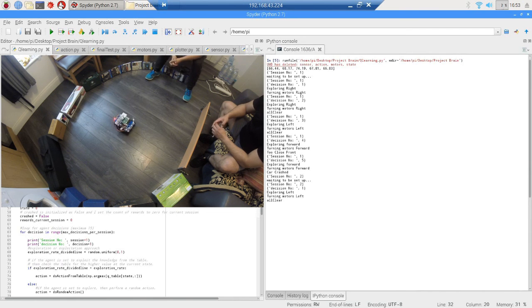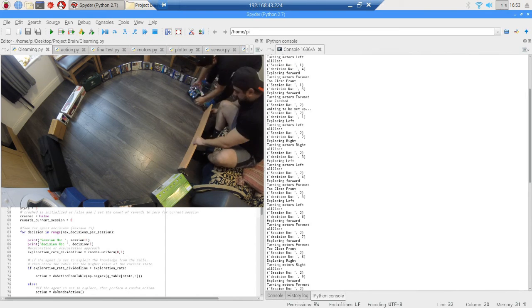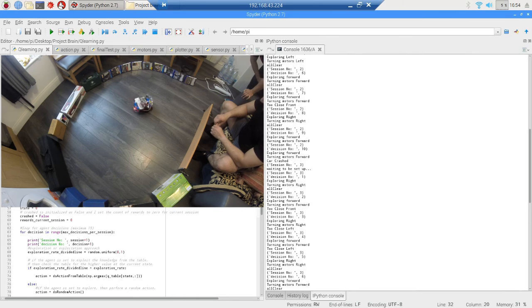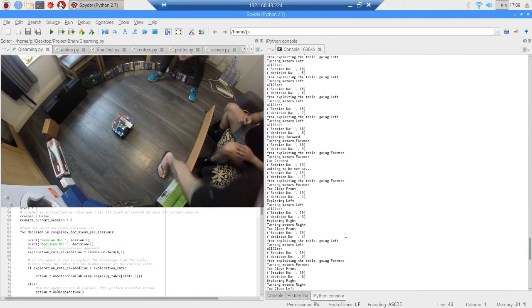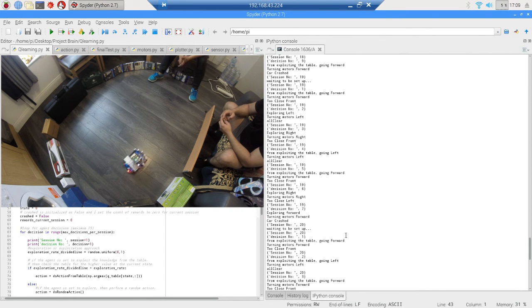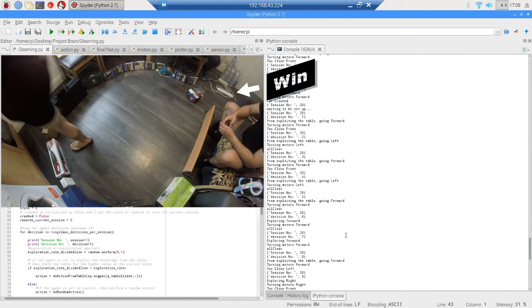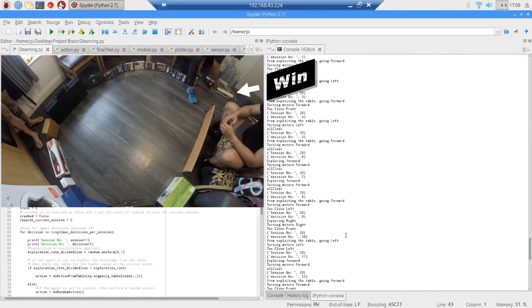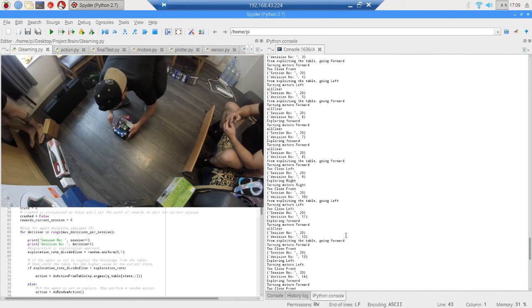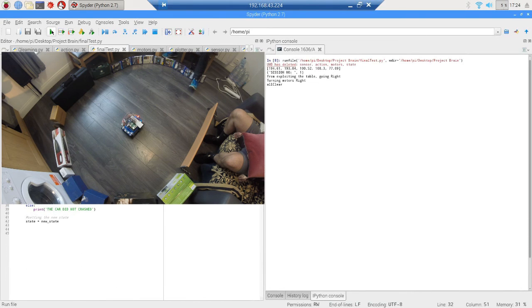To complete all the learning sessions, the agent took more than an hour. Sometimes, giving the results that we were expecting. After the learning sessions concluded, some interesting results were discovered in the final test.